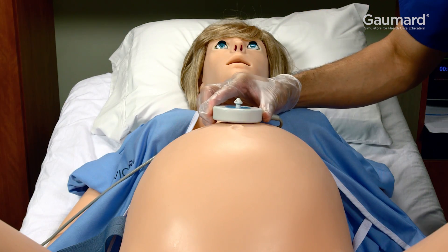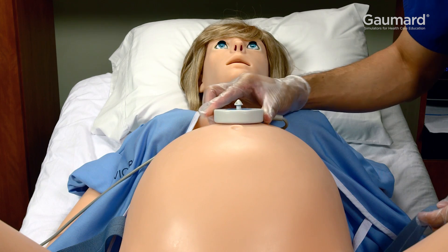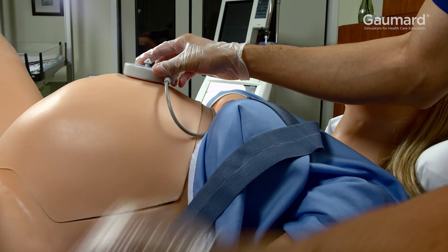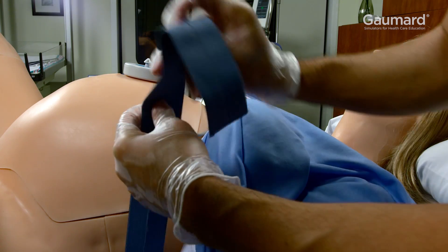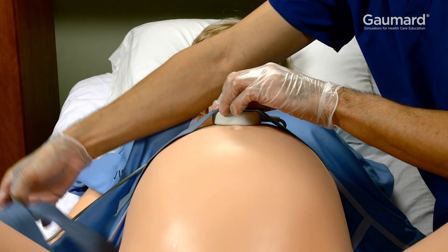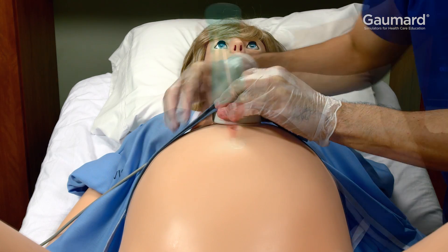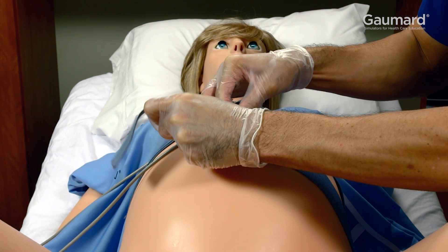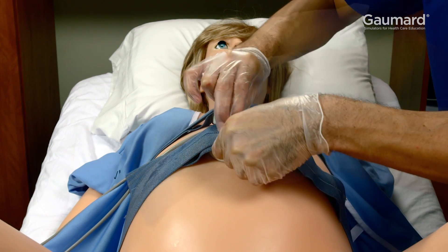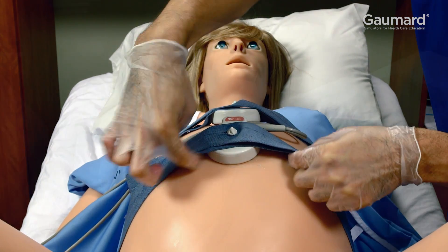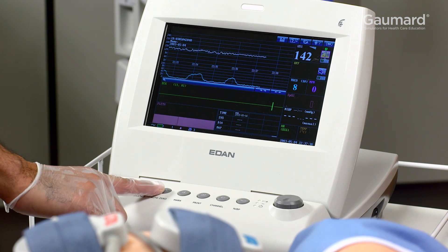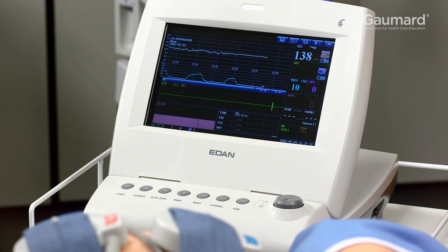The Victoria contraction abdomen can interact with real monitors for contractions and fetal heart rate. Place the contraction sensor as you would on a real patient, above the navel, and secure it with the straps. Use ultrasound gel for a clear heart rate and secure the sensor with straps. Once the sensors are in place, use a tokodynamometer to view the fetal heart rate and contractions as you would on a real patient.